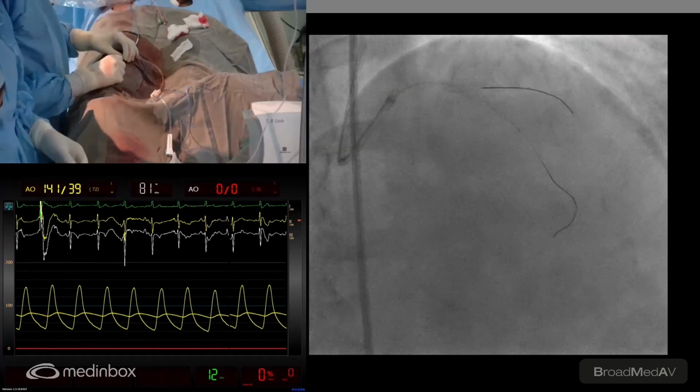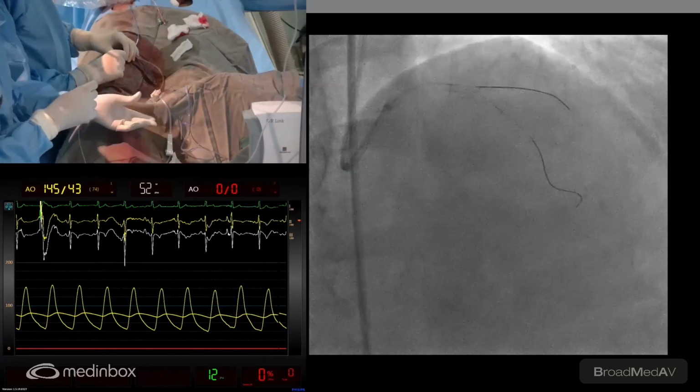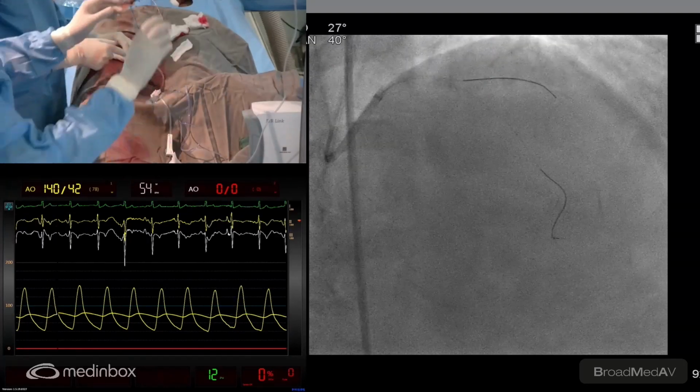Yeah, that's fine. You can give a little bit of GTN, yes, maybe. Yeah. I think they're doing.